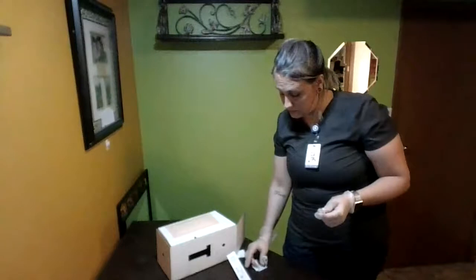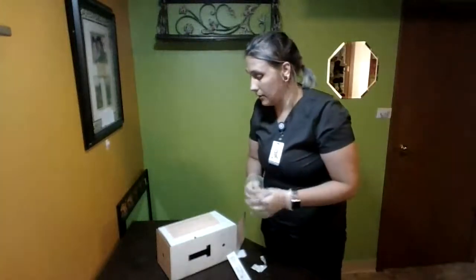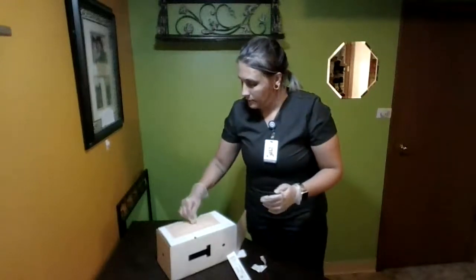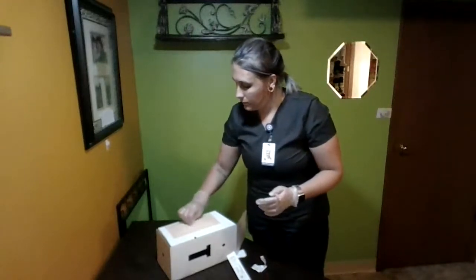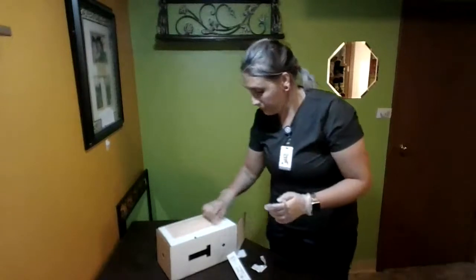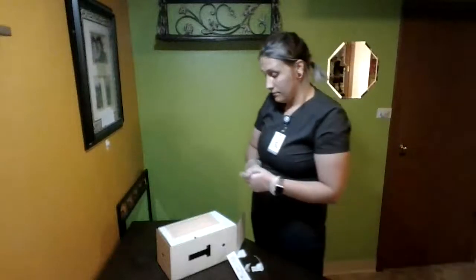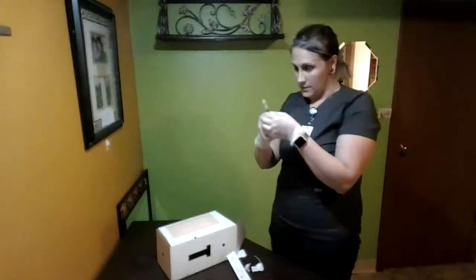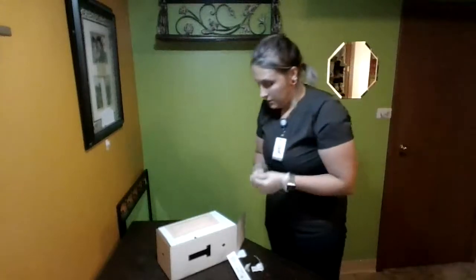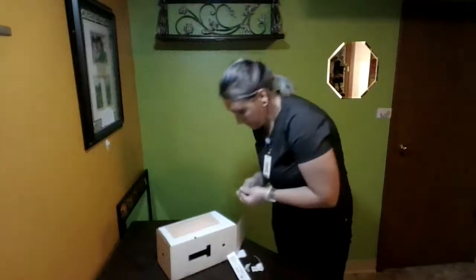But first thing I'm going to do is clean the site with the alcohol swab. So the site, I want it to be about in the middle of the arm. So right here, I'm going to start swabbing in the middle, working my way out, not touching the middle again. I'm going to wait for that to completely dry. Checking my medication for any air bubbles. Okay, now that that's dry, I'm going to go ahead and apply this.